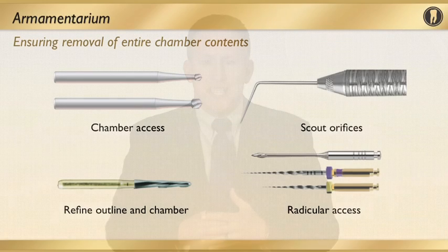Also of importance would be the non-cutting tip that is on the actual access burr. You cannot violate that sacred furcal area that we talked about once this burr is introduced into the tooth. It will not penetrate the tooth apically. Instead, it will laterally prepare the canal space in a way that will provide us with direct visualization and direct line access.